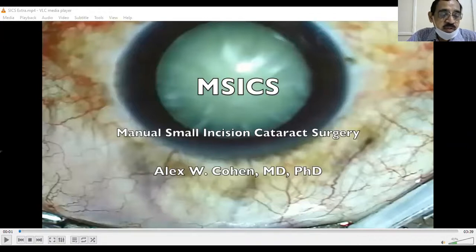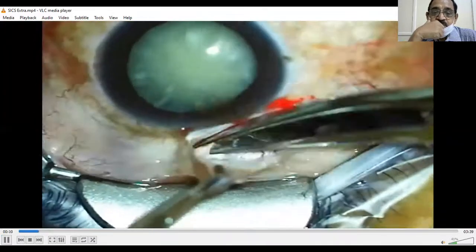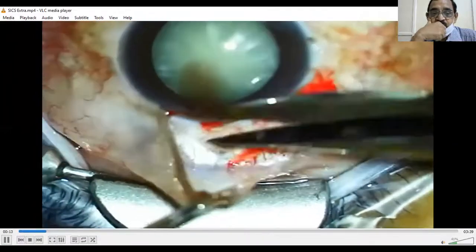So we start the video. This is one technique for performing manual small incision cataract surgery. This case was done while on a mission trip in Southern Africa. After retrobulbar anesthesia is achieved, the first step is to perform a peritomy for about 3 to 4 clock hours superiorly.